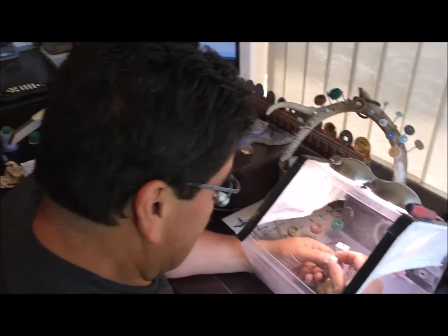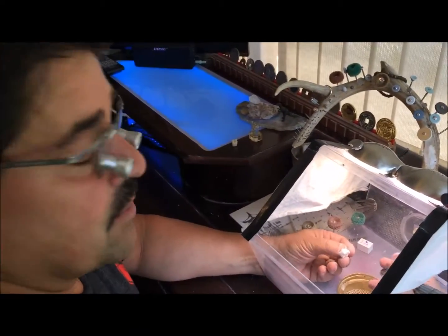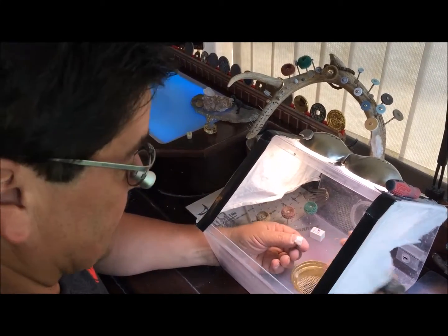Greetings! This is Stratt from Opa Dental. Today I'm going to show you the technique for reducing and smoothing pre-centered zirconia after it's been removed from the disc.